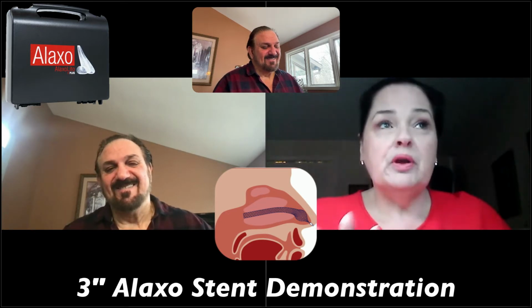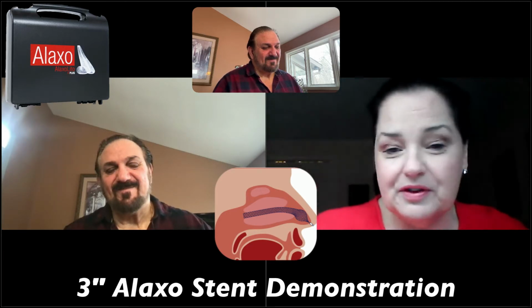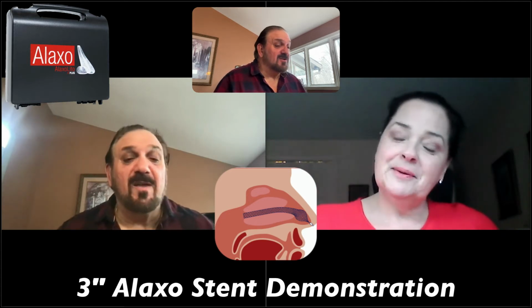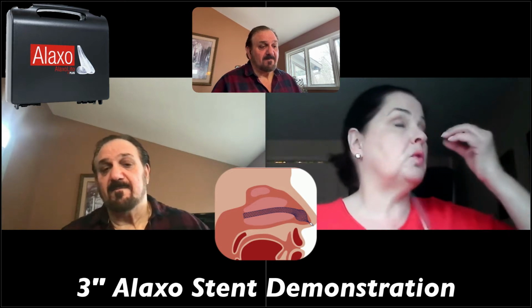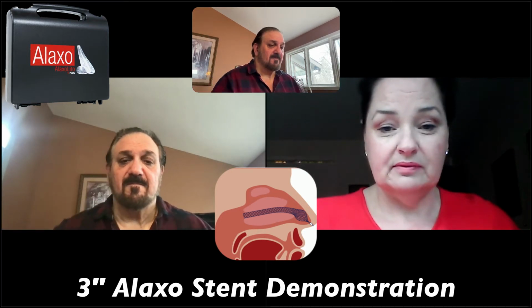At that point we tell people, just wear it as long as you can. It will subside a little bit. If you can only wear it for 20 minutes, then just wear it for 20 minutes. If you can only do the one side, just do the one side. It's okay. Typically you would be wearing it on both sides. With the 2 in the 3-inch, you would wear it on both sides because you want to stent open both turbinates so that you have nice free passage.